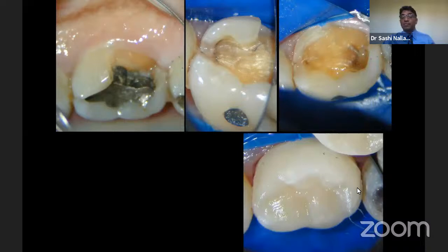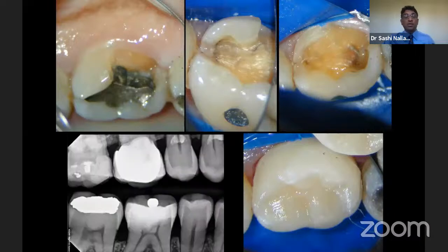It's a direct onlay. I just did it under the microscope in the chair. But you can also take an impression and prep the tooth and then prepare for an onlay or a crown in a scenario like this. So here is the tooth, and I normally tell these patients, look, there is a very high chance that this treatment alone is what you need, and you may not need anything else.